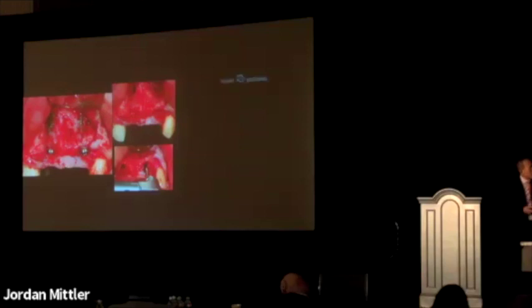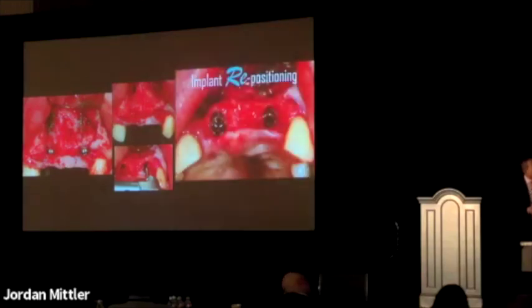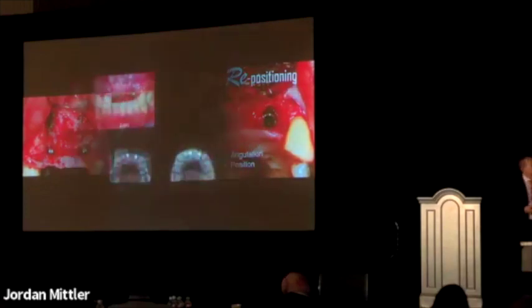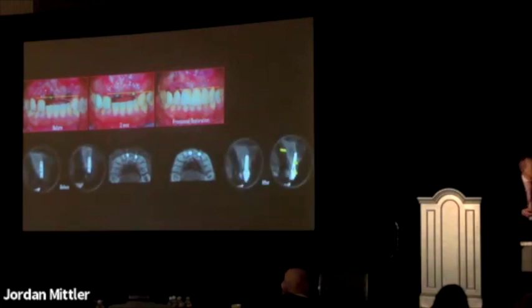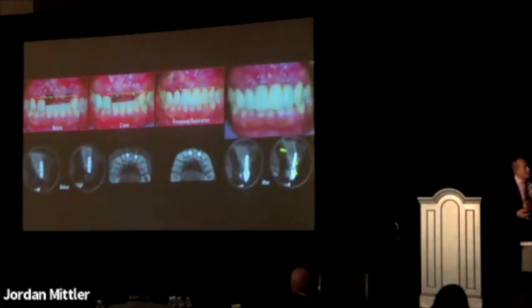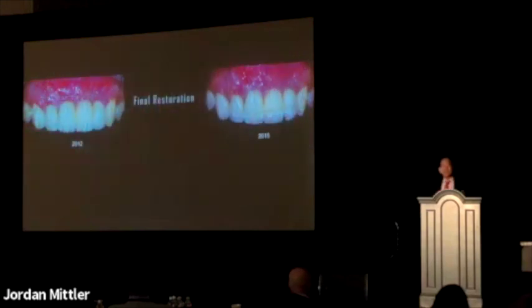So I told the patient, I can actually help you. I removed the implant and repositioned it. I re-angulated the implants towards the cingulum, moving it back from the buccal by about 1 millimeter. And just by doing that alone, nothing else, the harmony of the soft tissue came back. You can see the CT before and after. All I did was re-angulate just slightly. It harmonized and balanced all the soft tissue margins. A few years later, porcelain chipped on that, but you see how it harmonized the soft tissue.